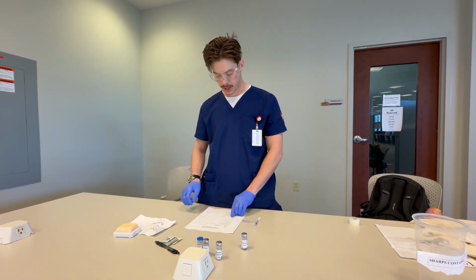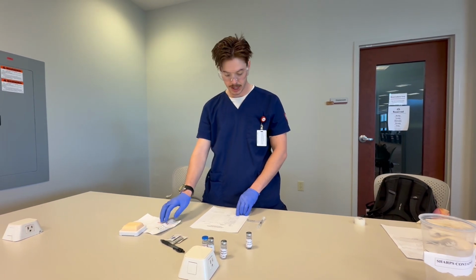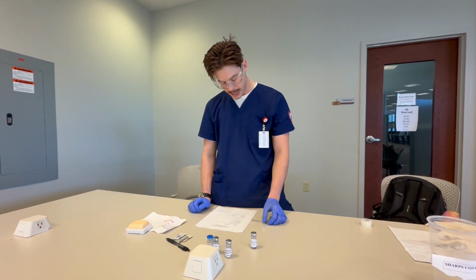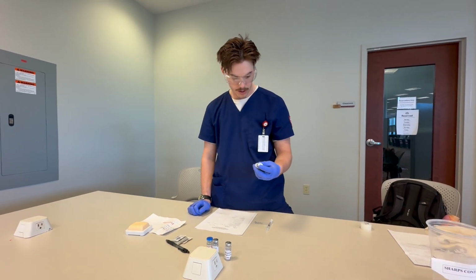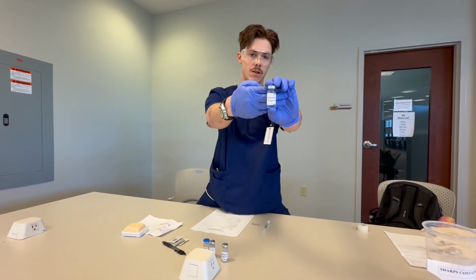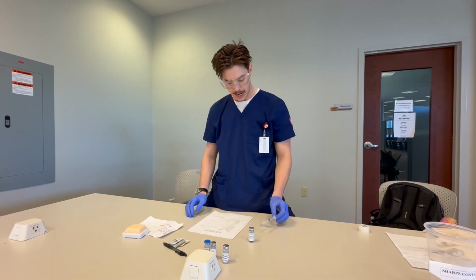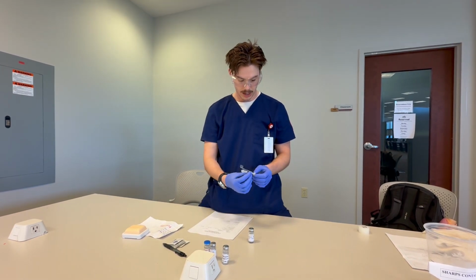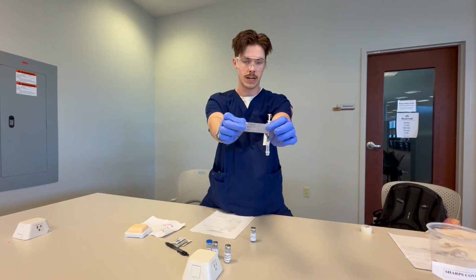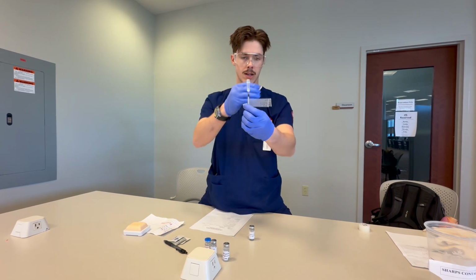So now I will begin my third check of accuracy. Jaguar J. Jones, medical record number 4176352. Got it. I have with me Novolin R regular insulin, which is the right drug. I have the right dosage here. I have a subcutaneous needle. Right dosage, Jaguar J. Jones, 10 units, which is what I have in here.